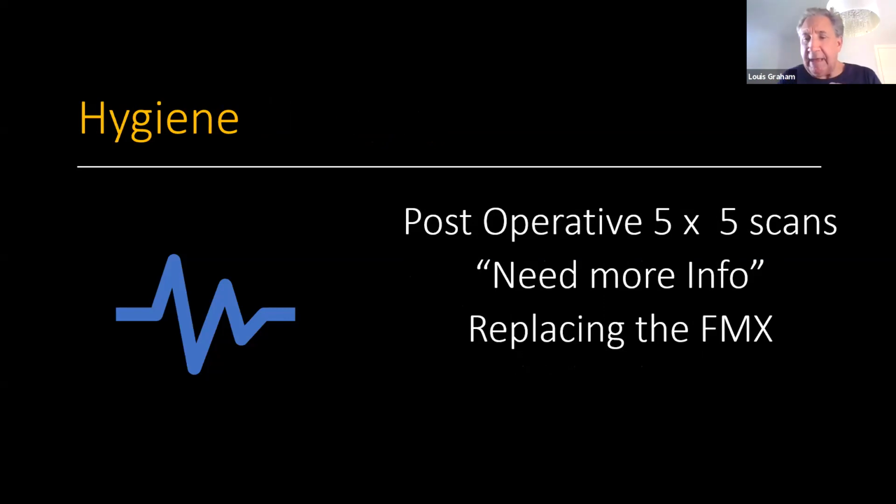And we no longer take FMXs. We just don't. John Julian, who you'll hear speak, turned me on to this concept maybe 3 years ago. And kudos to John Julian, by the way, a great speaker, great implantologist as a general dentist. And I haven't taken an FMX in 3 years. There's no reason to, because what happens is you take an FMX and then you have all these question marks and then you end up taking a cone beam. Well, why take the FMX?